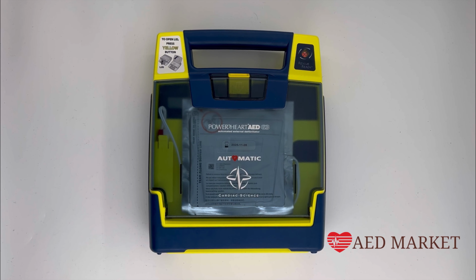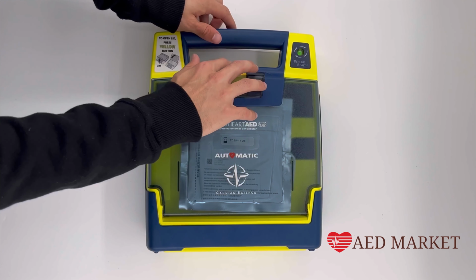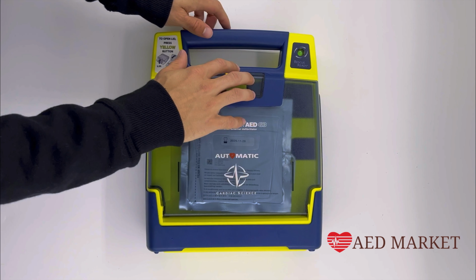After replacing either the battery or the pads, the AED's ready indicator will remain red until it completes its nightly self-test. To change it to green, simply open and close the lid. When you see the green indicator, you can be confident that your AED is in optimal condition and emergency ready.